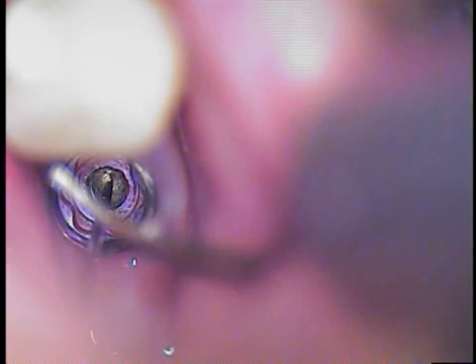Testing again with — that's either a periodontal probe or an endodontic explorer, I'll try to have both of them. I'm going to make another attempt with the ultrasonics. The patient is not feeling any pain whatsoever, no discomfort throughout the entire process. I'm turning in a counterclockwise rotation as I use and touch with the ultrasonics.